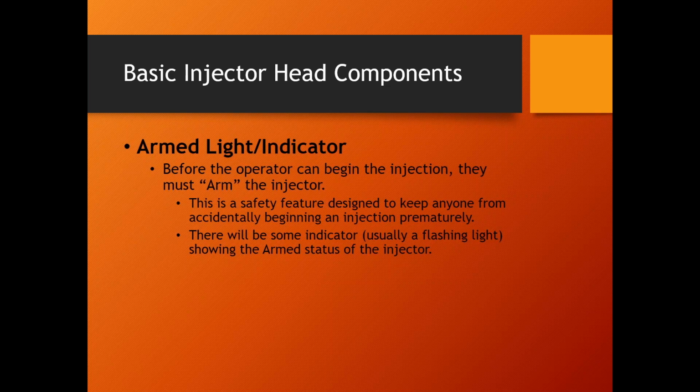So these are your armed indicator lights. It's telling the operator when you hit the start button, we're going to shoot. And then red is abort, yellow is start and pause. So we'll start the injection. First contrast, flow rate of 5, a volume of 20. Then it automatically moves over to the next one. All right, 2 shots, 1 protocol. So that's a 2-phase injection.